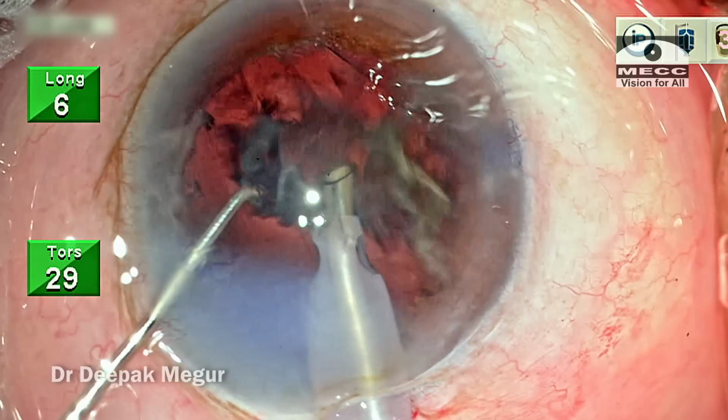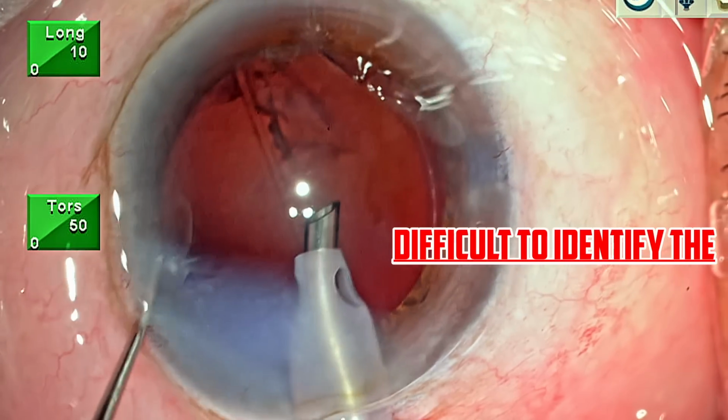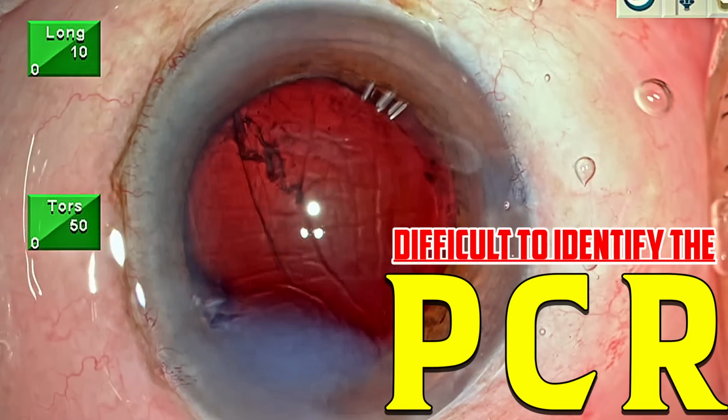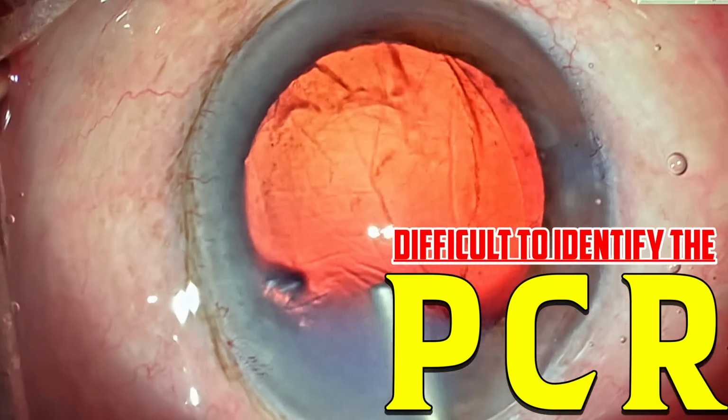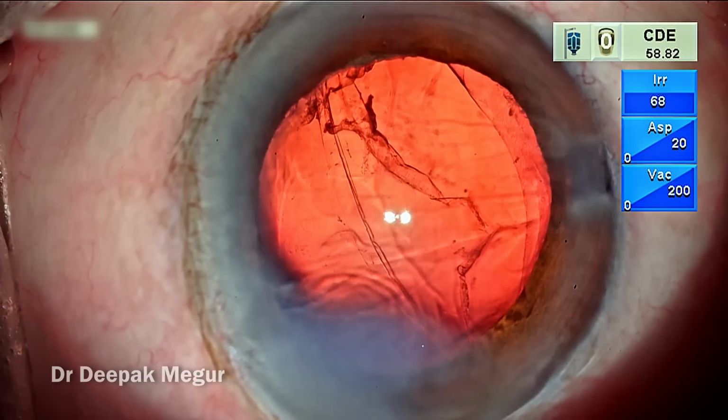Hi. Sometimes it would be extremely difficult for an experienced surgeon also to delineate the exact location of a posterior capsular tear. Now, I had one such recent experience and I'd like to share it with you all.